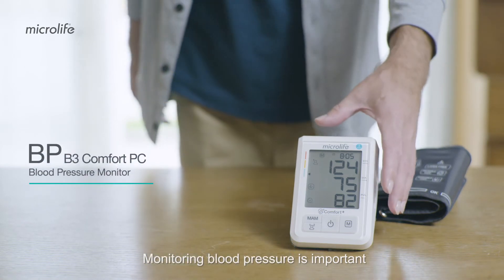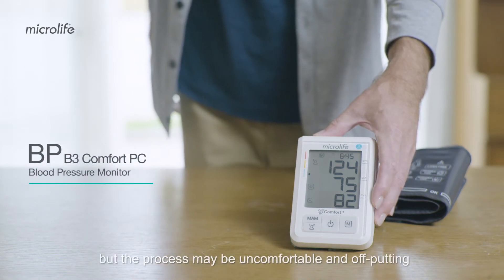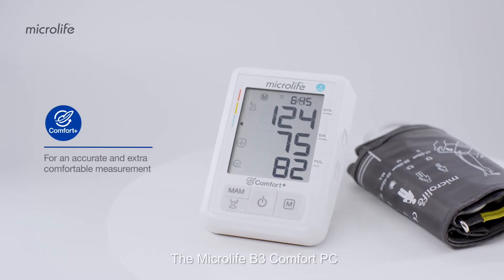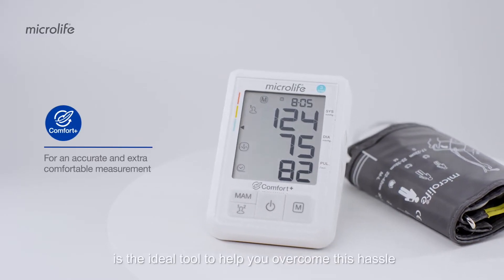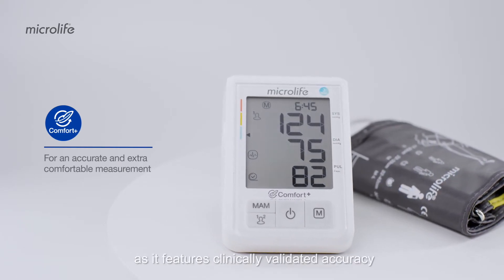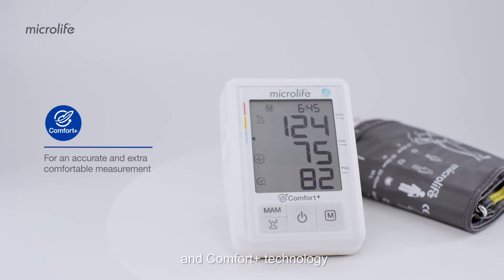Monitoring blood pressure is important, but the process may be uncomfortable and off-putting. The Microlife B3 Comfort PC is the ideal tool to help you overcome this hassle, as it features clinically validated accuracy and Comfort Plus technology.